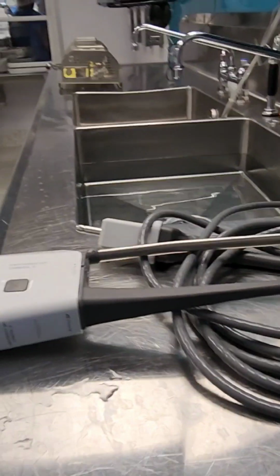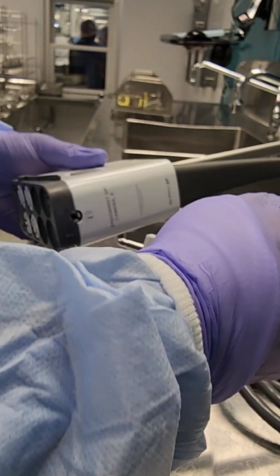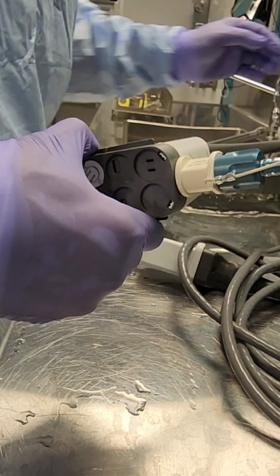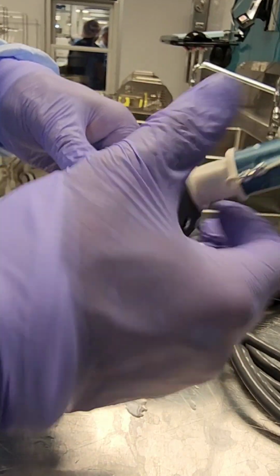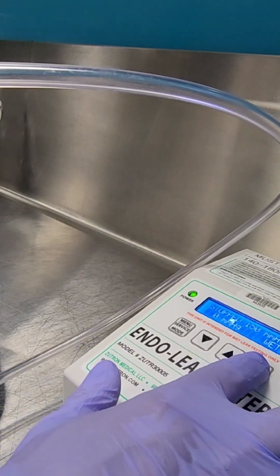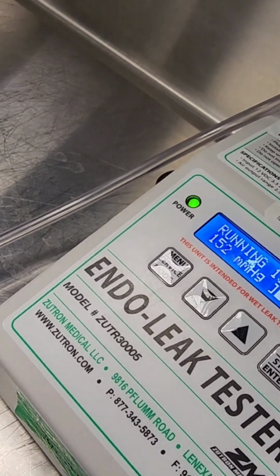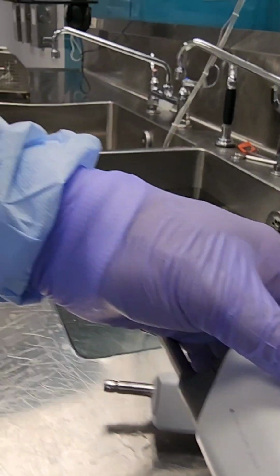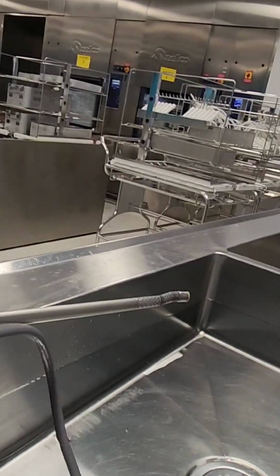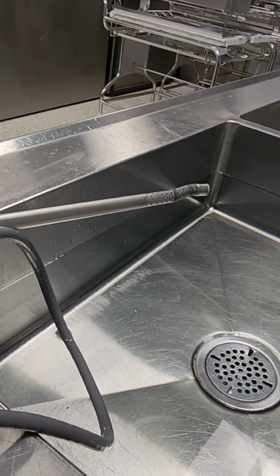Turn off your leak tester, and then we're going to go ahead and connect our leak tester to the appropriate port here and ensure that it lays flat. Now this thing just slides in and connects. There's no locks or mechanisms, so just hold it down to keep it in place and make sure it doesn't fall out of place. You're going to turn the device on to pressurize it. You will hear the machine humming, and then it should be in the specific range that is required, between 140 and 180. You'll see something like 153, and it should be steady.